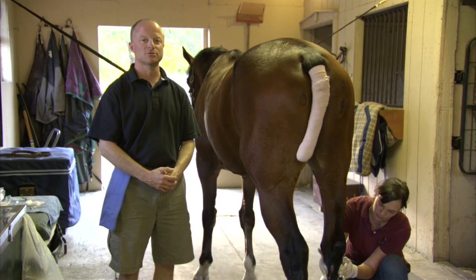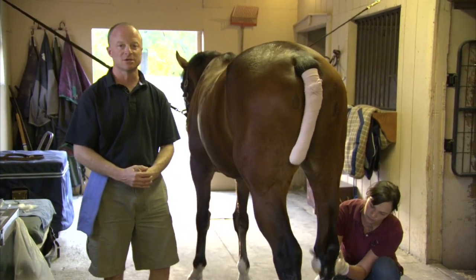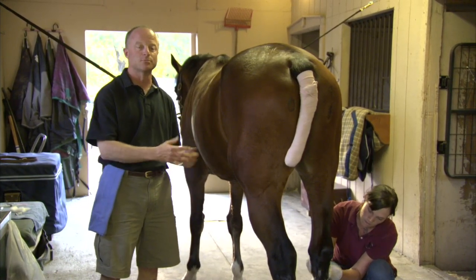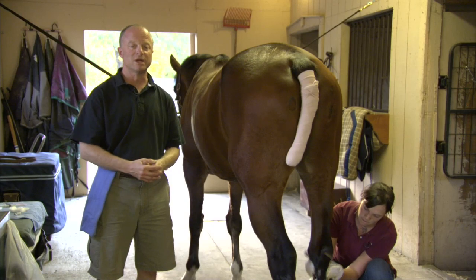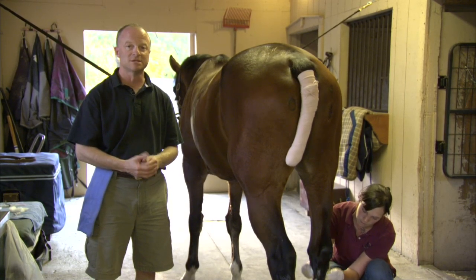Hello, I'm Dr. Bob Neff for Equestrian Nation and today I'm going to talk about injecting joints on a horse. This is Google, and we have done a lameness examination on him and determined that he needs to have some work done on some joints to make him feel better. Sometimes horses, when they are performance horses and ridden a lot, they get sore joints and so we have to inject their joints to make them feel better.